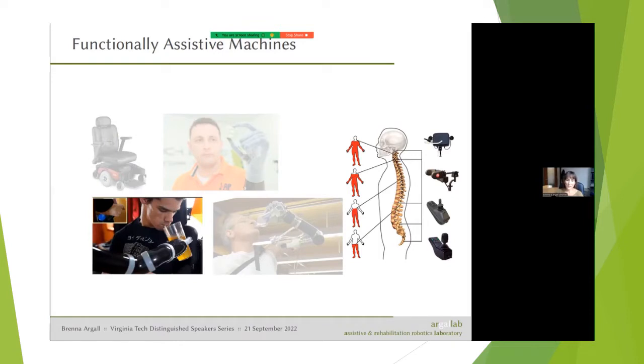And so you have this paradox where actually the more likely you are to need assistance from a robotic arm, you're more likely to need that assistance if you are unable to use your own arms and hands. And yet, if you're unable to use your own arms and hands, you're probably going to be limited to these more restricted interfaces that only cover perhaps 1 or 2 control dimensions, and that are not proportional.